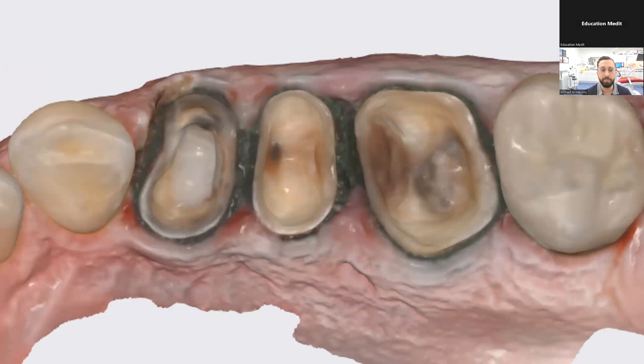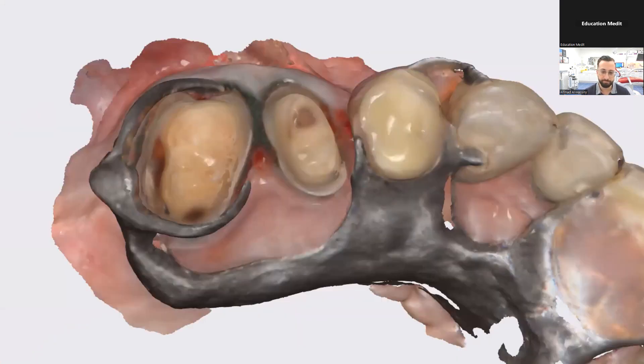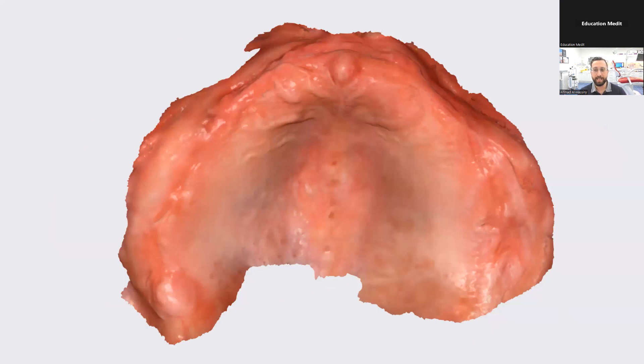You'll notice there are some deep margins here from old root canals with old fillings that needed to be removed. So how do you manage deep margins? Anyone looking at this scan may notice there's retraction cord everywhere. I am a big proponent of using retraction cord — any time you scan a tooth prep, you should be using retraction cord. Then there's metal scanning, which I think has a lot of misconceptions. A lot of people think you can't scan metal or that it's very difficult. And of course, another tricky case is the full edentulous scan, widely believed to be one of the hardest scans to take.